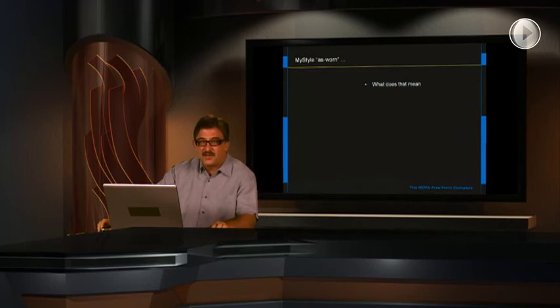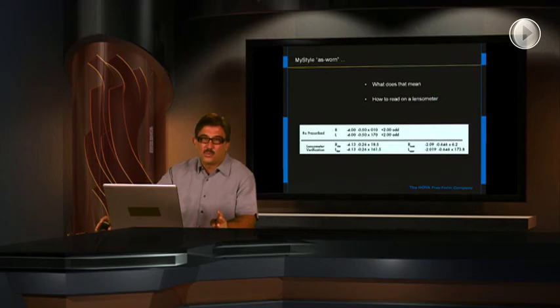And when the lenses come back from the laboratory, I want to make a couple of things very clear here. This is an as-worn type of lens, which is to say there have been adjustments made to the Rx powers that you'll read on the lenses to adjust for things like the marginal astigmatism due to the variations in vertex distance, pantoscopic angle, and facial wrap of the lenses. These are adjustments that are made to the Rx powers so that the patient will actually see what was intended through the powers that were prescribed.